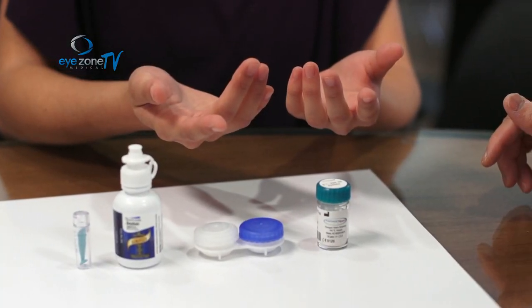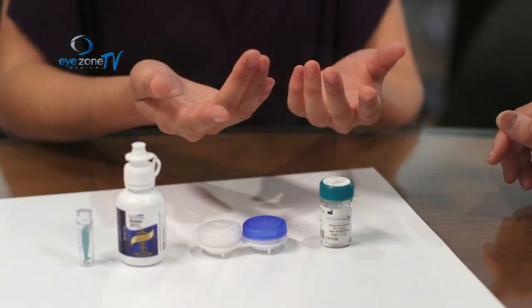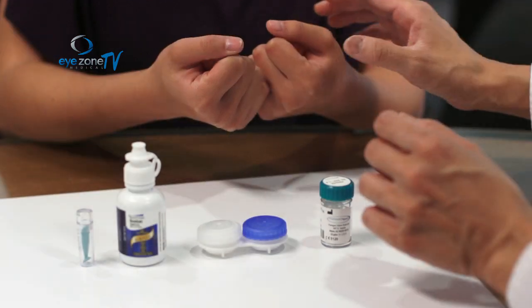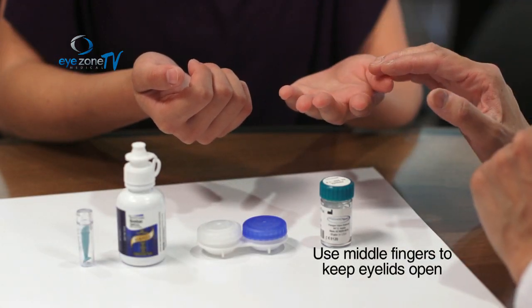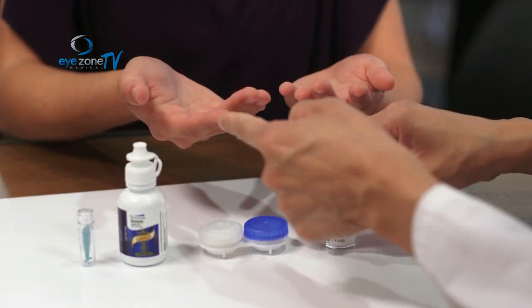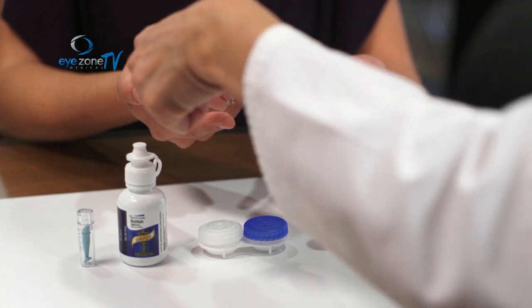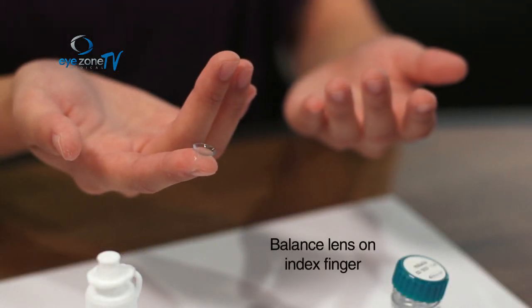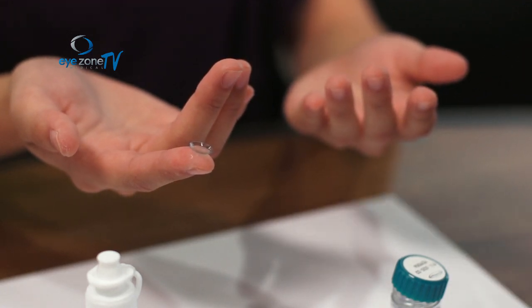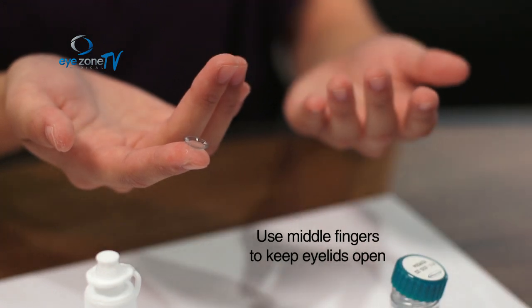You're going to put the contact lens directly into your eye. It can be tricky because your eye will naturally want to close, so you need to keep your eyelids open. Use the middle finger of each hand to hold your eyelids open — that way you leave your index finger free to balance the contact lens and place it in your eye.